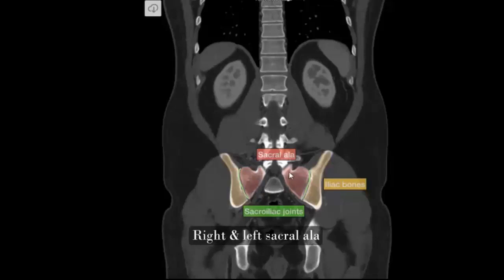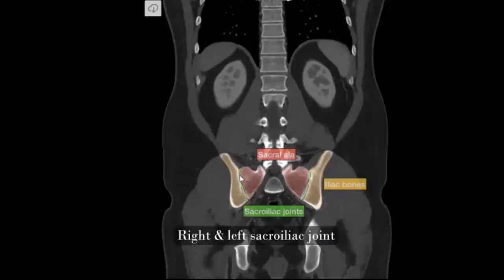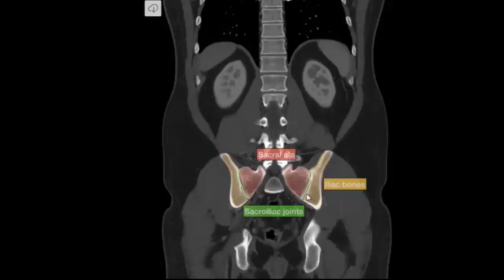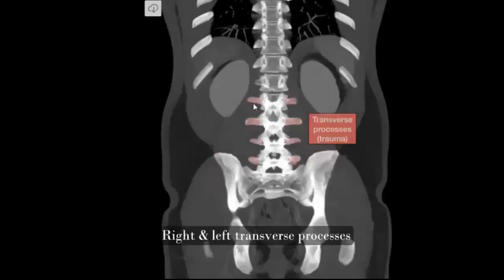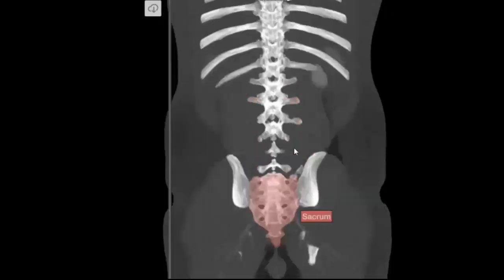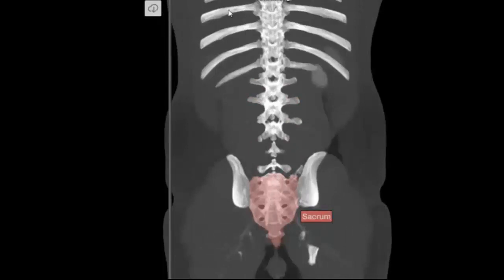Right and left sacral ala, right and left sacroiliac joints, right and left iliac bones, right and left transverse processes, sacrum, right and left ribs.